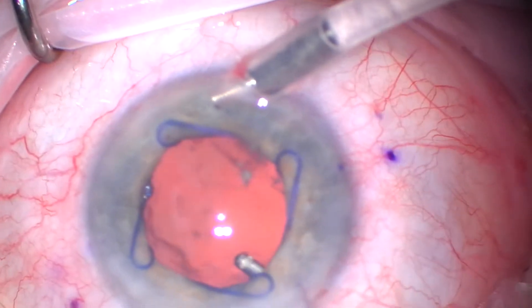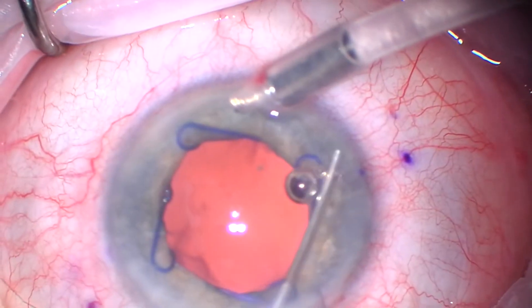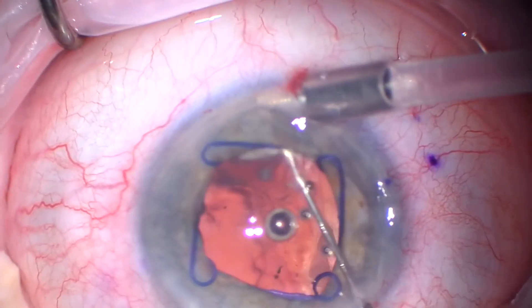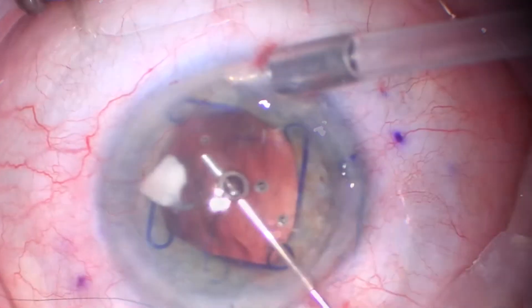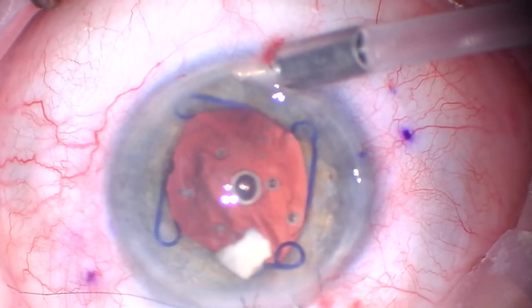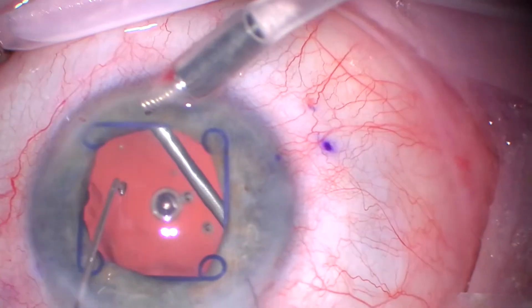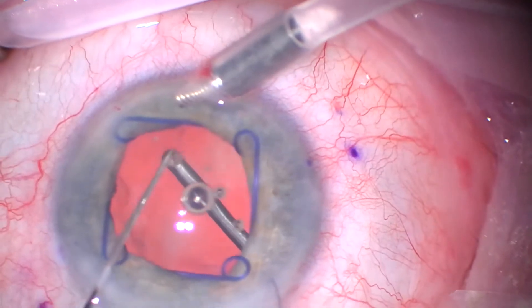I thought about editing all of that stuff out, but I think it's good to see this because you do need to deal with it. More Viscote again, starting in the angle and using the iris as a shelf. Here I've got what I think is a Kuglin hook — I hooked some capsule and pulled some capsule out there, still Viscote-dissecting. I promise it was capsule, not vitreous. But again, we have burped stuff out and that's potentially a dangerous maneuver if vitreous came out and put traction on the retina. So I always immediately go back in and do more vitrectomy.